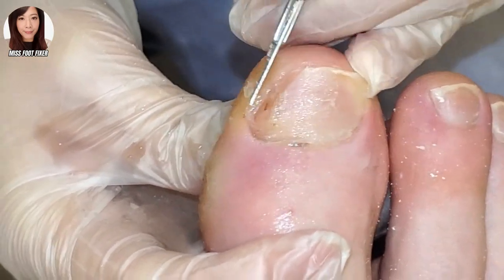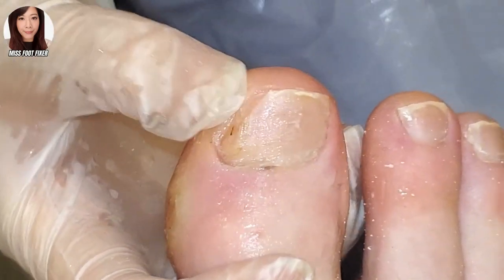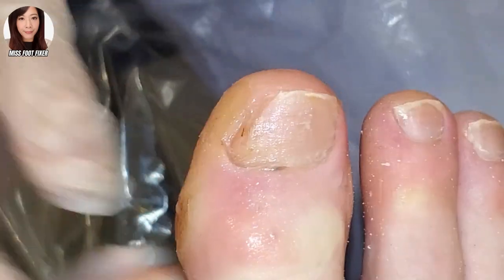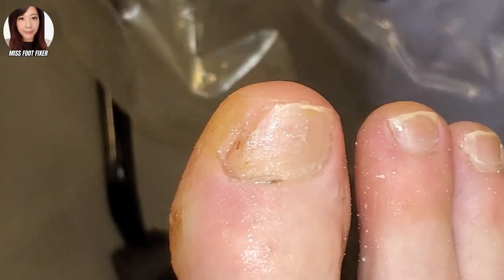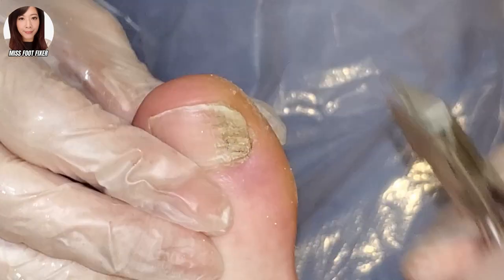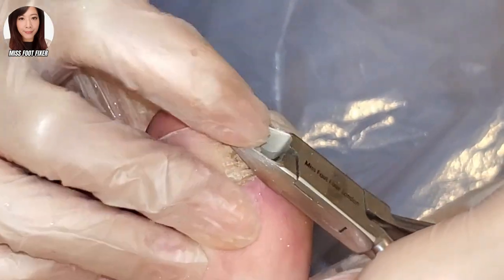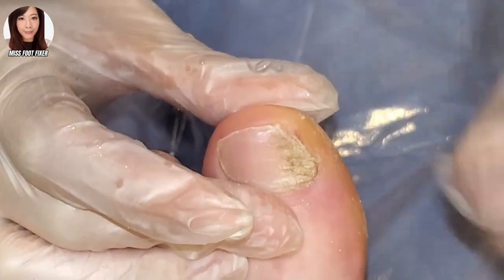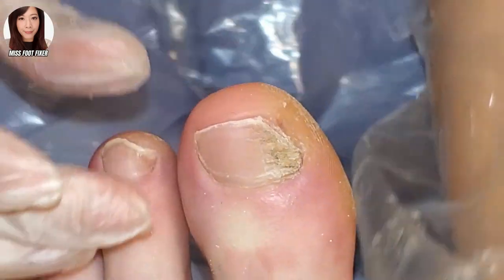What size are you? 14, 14 and a half. So we'll look at this side too — we'll have the same kind of issues on this side as well. We're going to cut this. Again, you've got a callus build-up here, though it's not as bad — there's less colour from this side.